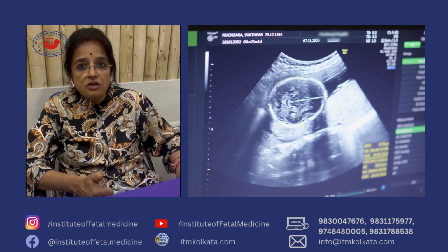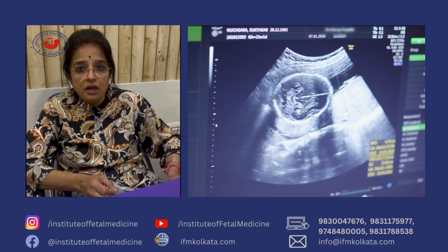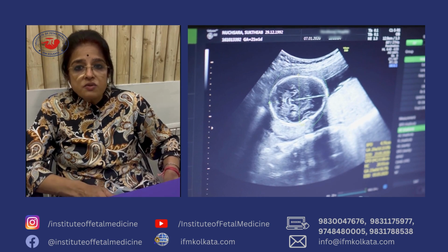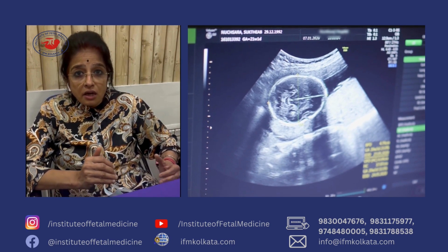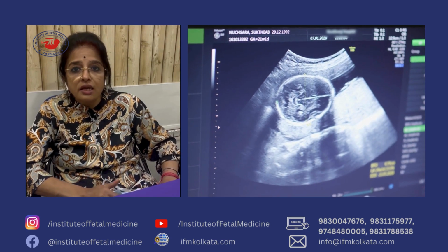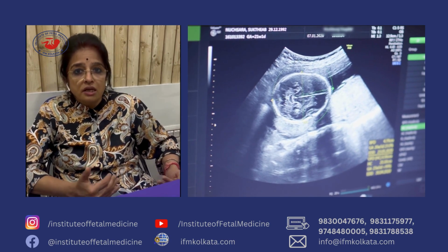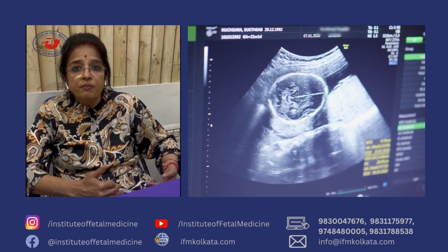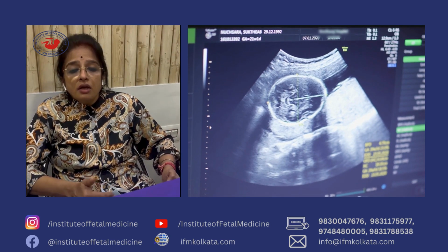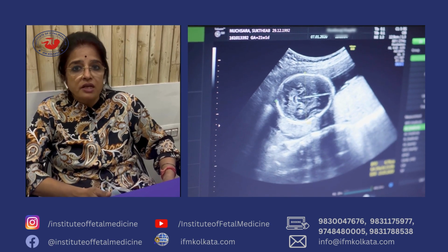But TVS cuts short that limitation and we can get direct access to get a very crisp and accurate picture of the organs. Thirdly, transvaginal sonography involves only sound waves and does not involve any ionizing radiation, unlike X-ray or CT scan. The cost is also much lesser than an MRI, where we have to pay a lot more to get a good imaging diagnosis. Transvaginal sonography again is done very quickly and it is a painless procedure.